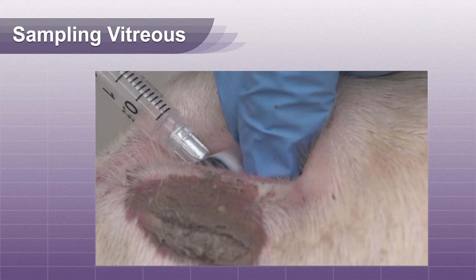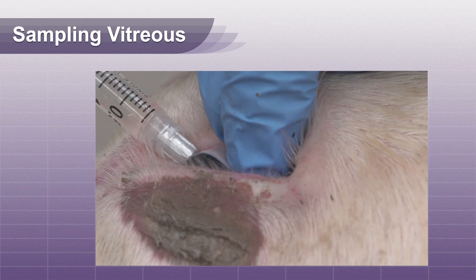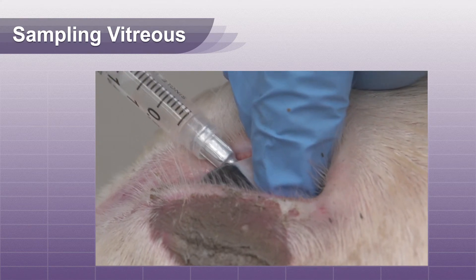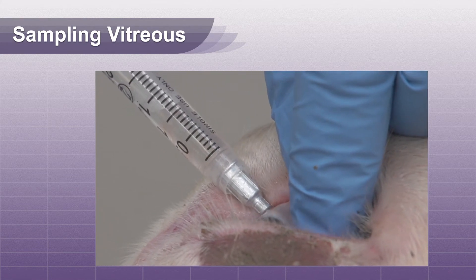The vitreous fluid is much thicker and requires a larger bore needle. Aspirate 1-2 ml of fluid and transfer to your sterile tube. Aqueous fluid is preferred, but vitreous fluid may be tested if aqueous is not available.